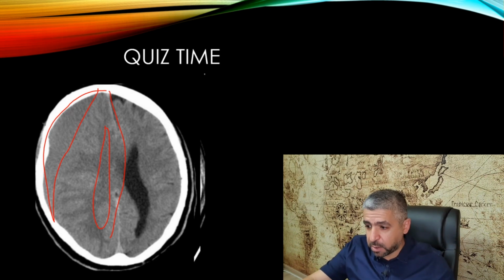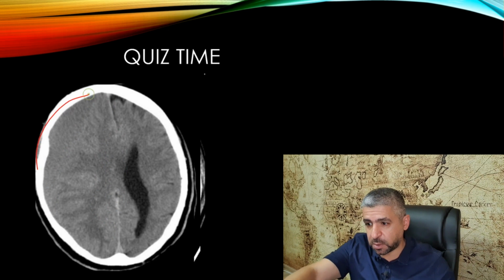But why? Because if you look, it's not limited by the suture. It's crossing the suture. It's not crossing the falx or the dural reflections. And it's following the surface of the brain, and it's crescentic in shape. Typical subdural hematoma. And it's isodense. It's either hyperacute or the patient is anemic.